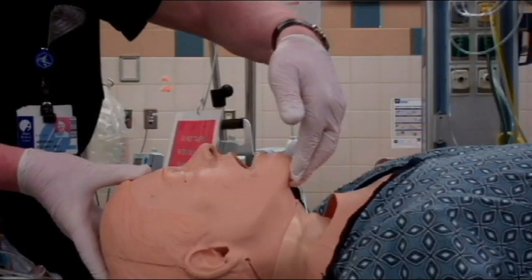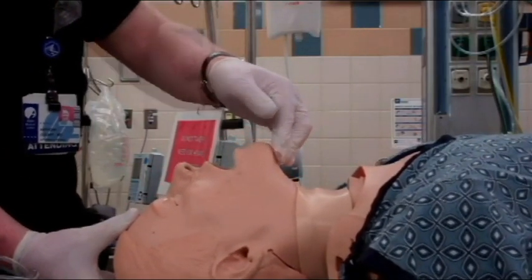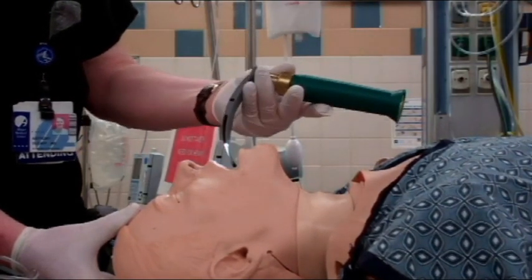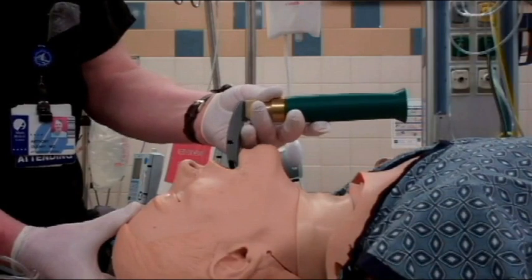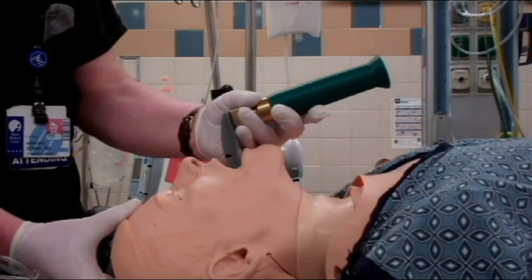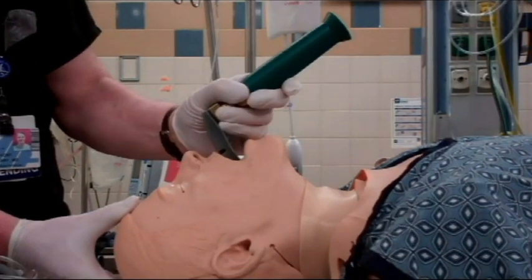So in summary again, extend the head on the neck if it's safe to do so and the mouth pops open. Place the tip of the laryngoscope blade into the right paralingual gutter, displacing the tongue to the left. Advance the laryngoscope blade 2/3 of its length and then perform the first lift, directing the laryngoscope handle diagonally upwards towards where the ceiling meets the wall. This 2-lift technique is predicated on the fact that many learners insert the blade too far the first time.